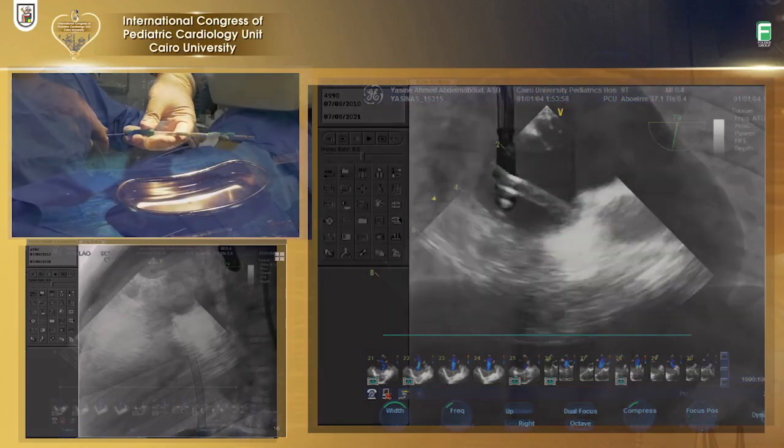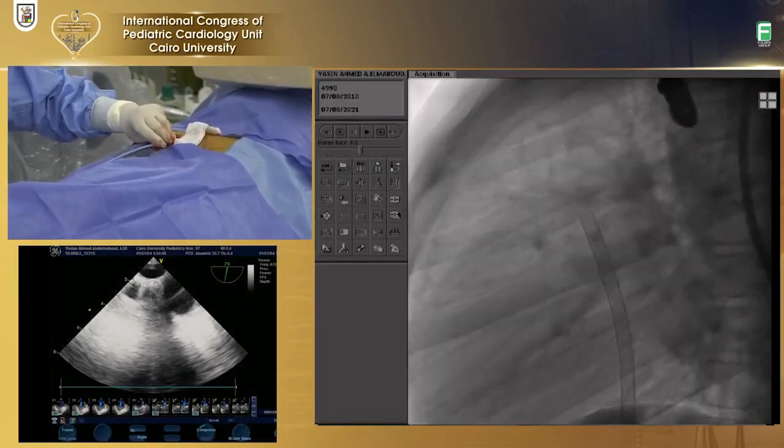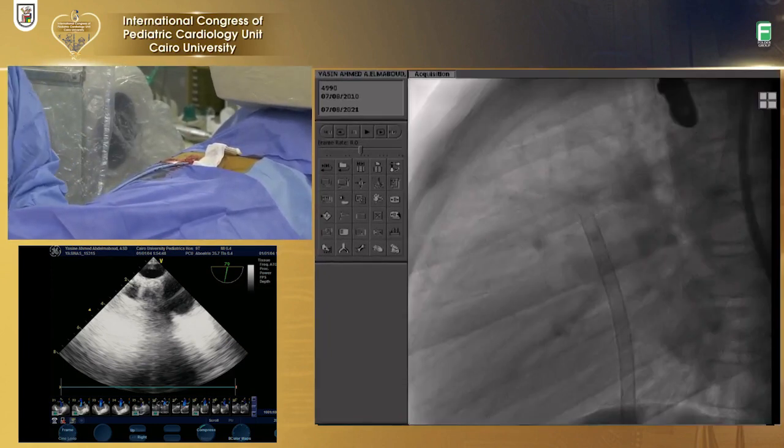We repeat our procedure. Okay, I got it. I got it. Okay. So we are adjusting ourselves.